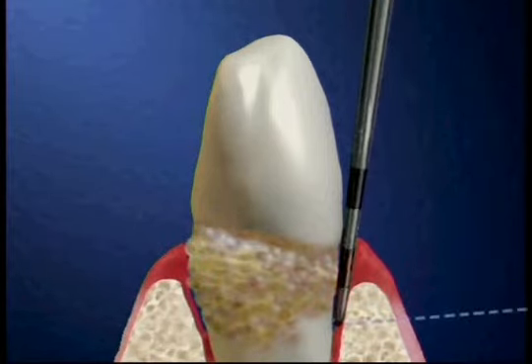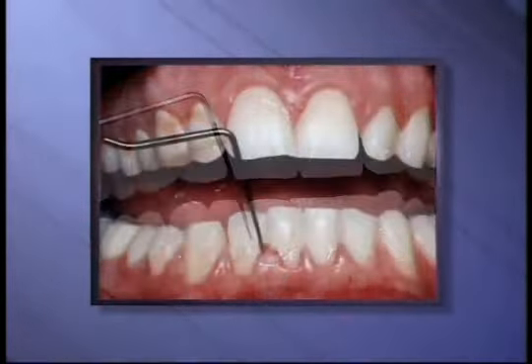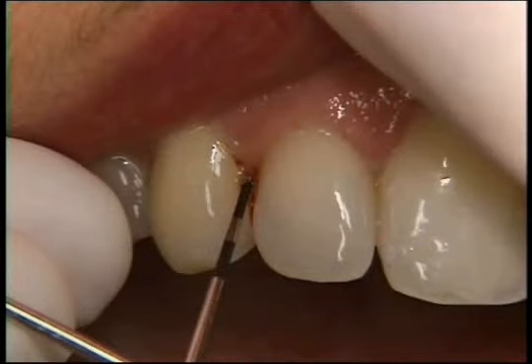We measure the depth of this pocket with a periodontal probe. The measurement is from the bottom of the pocket, where the gum is attached to the tooth, to the top of the gums. These are healthy gums. They're tight against the teeth, and there aren't any pockets. Now notice the difference with early periodontal disease. In general, the deeper the pockets, the greater the spread of periodontal disease.